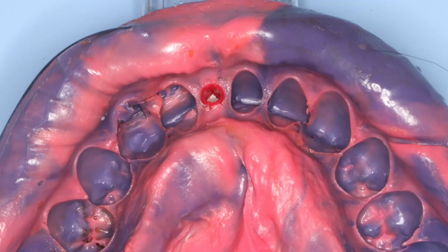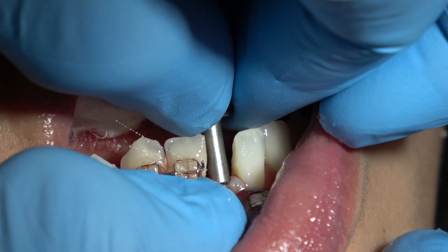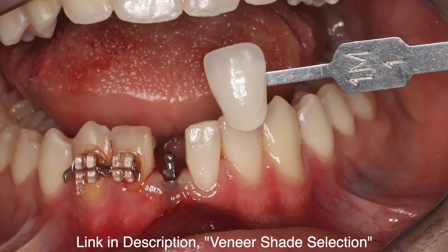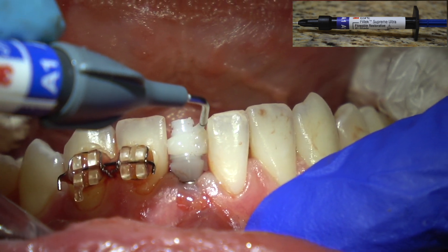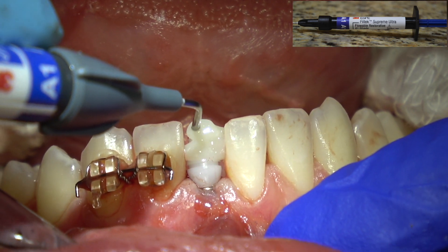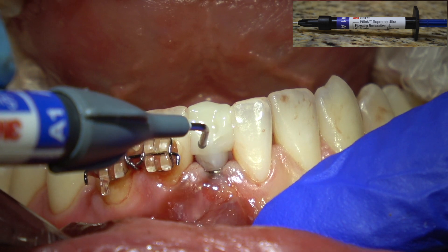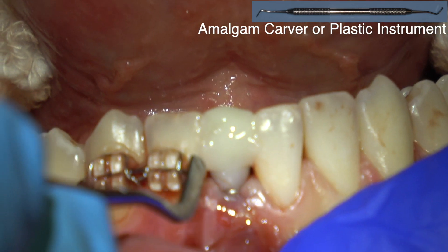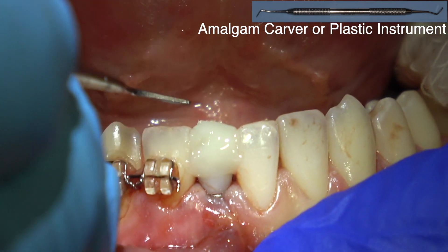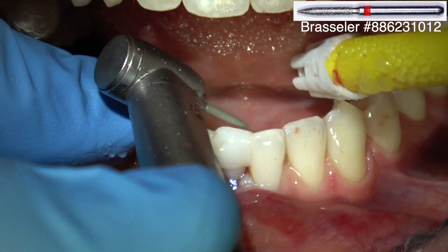Here's the impression coping — just checking the implant. I'm going to take a shade and then this is the provisional coping. You pop that on the tooth and then squirt flowable on it. I'm not going to cement it — I'm just going to let the flowable composite contact the adjacent teeth. I'm not worried about going down to the gingival line. Like I said, it's not in the aesthetic zone. I'm going to adjust that provisional — it's a high-water provisional, supragingival, not in the aesthetic zone. Take it out of occlusion.